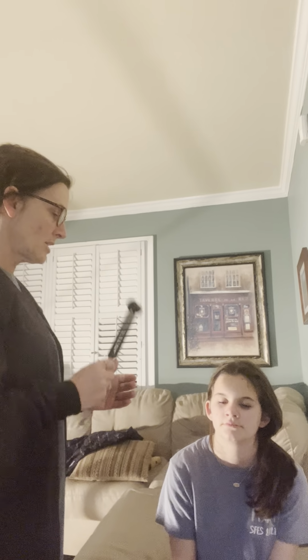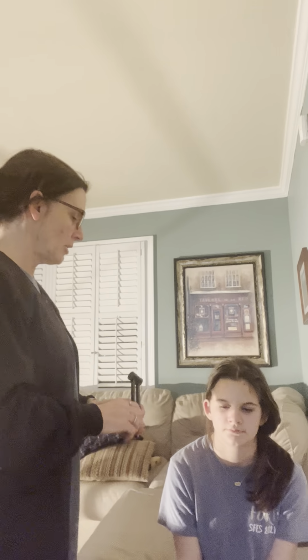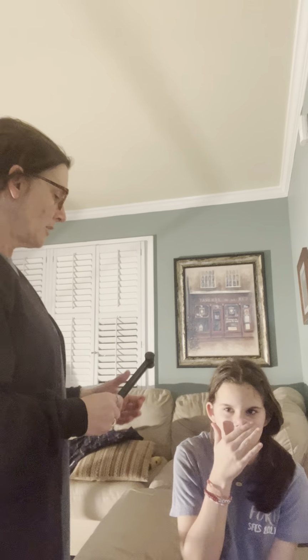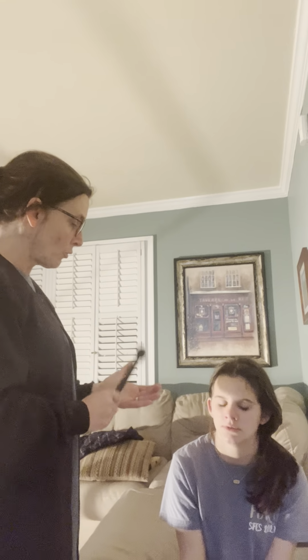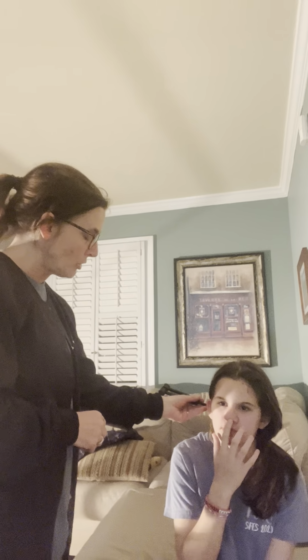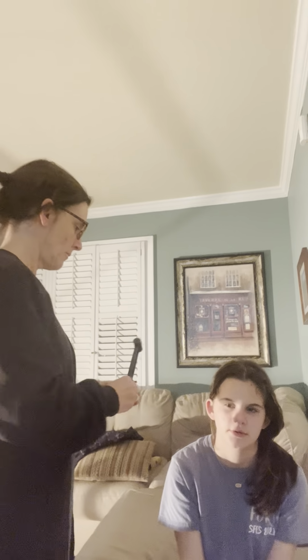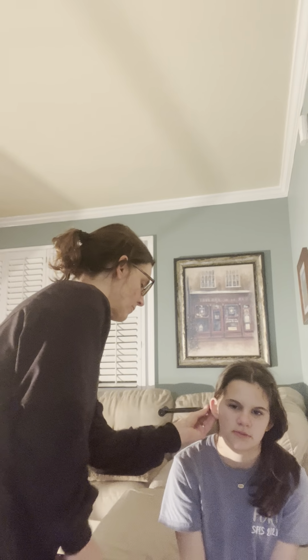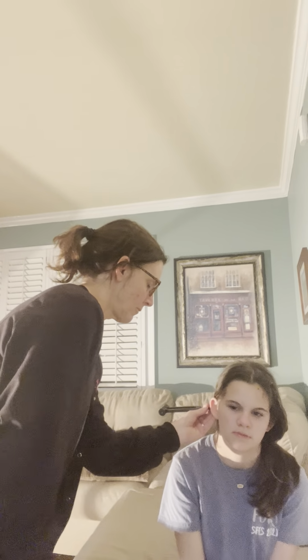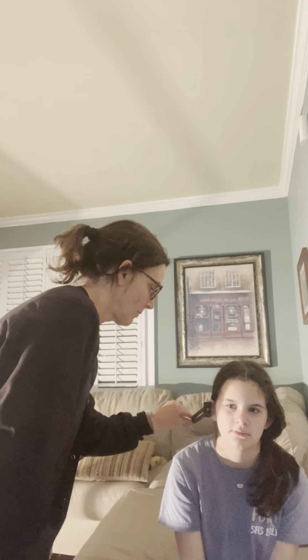With the Renee test, I would do the tuning fork. I want to put it behind the ear on the mastoid bone. Then I'm going to activate it and put it back here, and I need you to let me know when you don't hear it anymore. Okay? I don't hear it anymore. I don't hear it anymore.